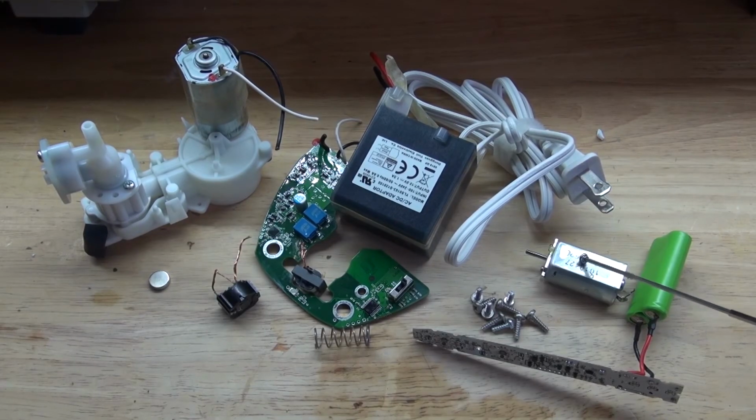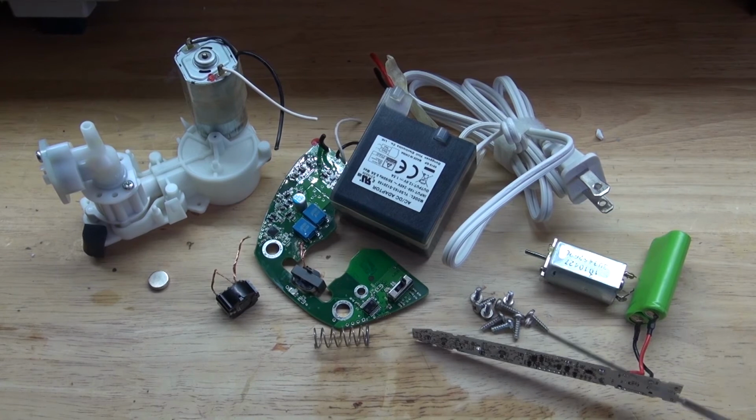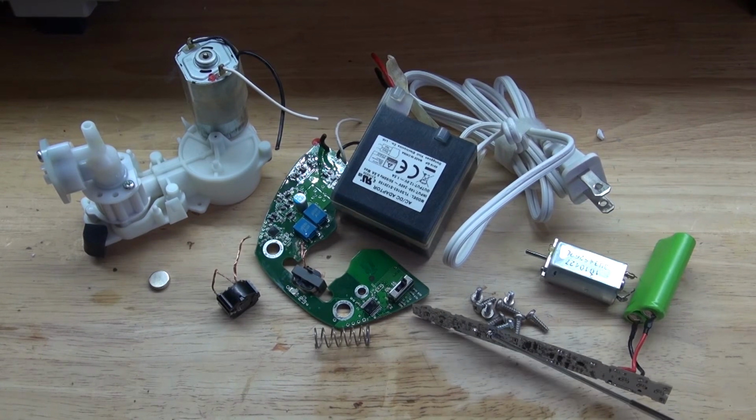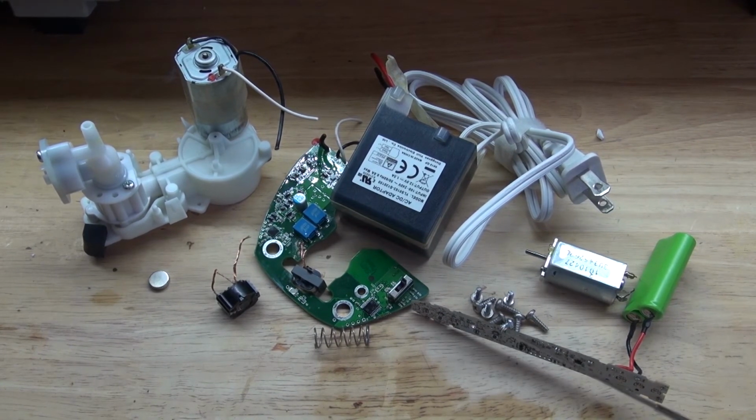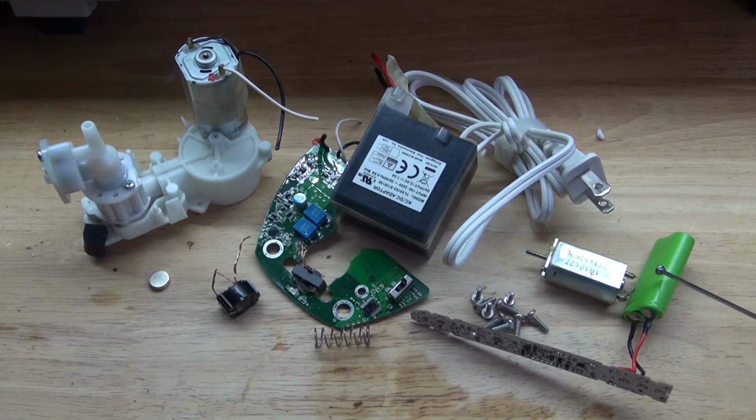And this right here is the DC motor. I could possibly use this DC motor for something. Screws are very useful. A spring can be useful too. This circuit right here goes to the electric toothbrush. I can definitely use this for a future project. In fact, in a future video, I have an idea of something I want to try with this.